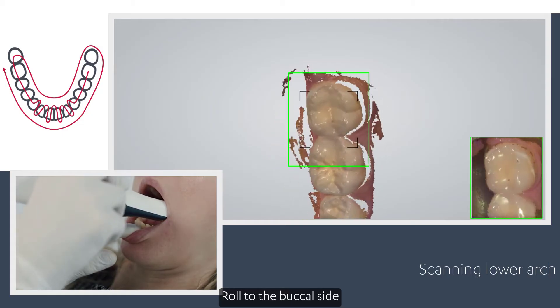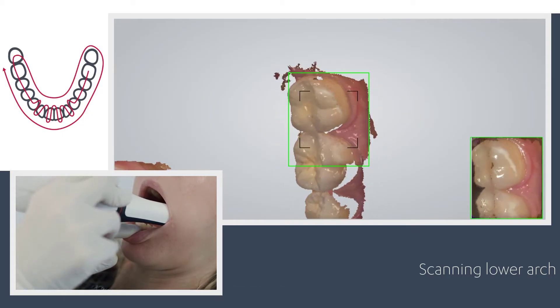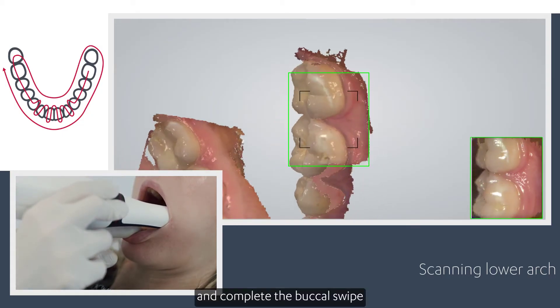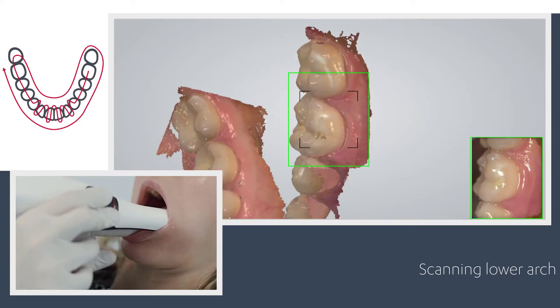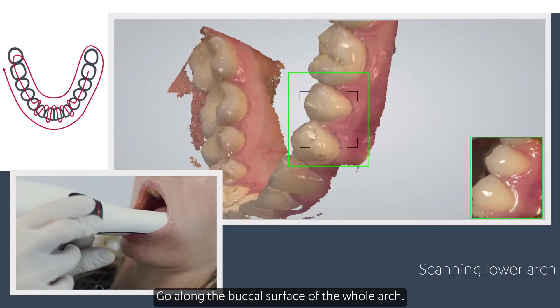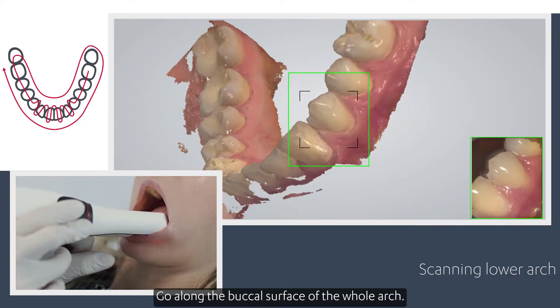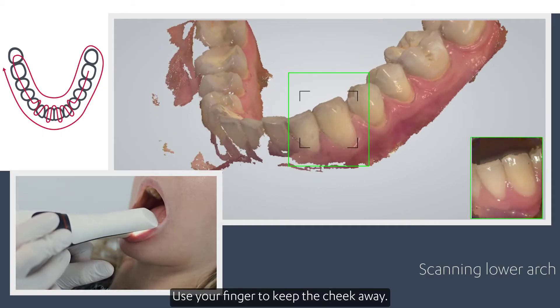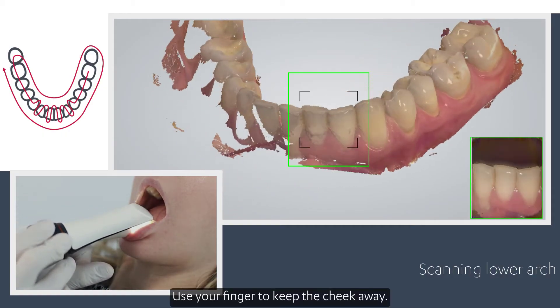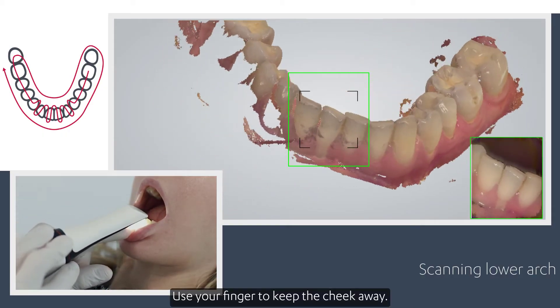Roll to the buccal side and complete the buccal swipe. Go along the buccal surface of the whole arch. Use your finger to keep the cheek away.